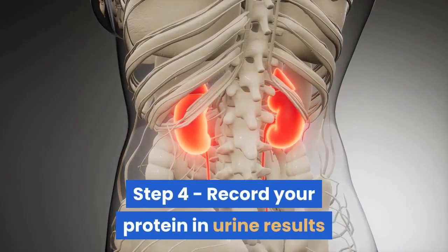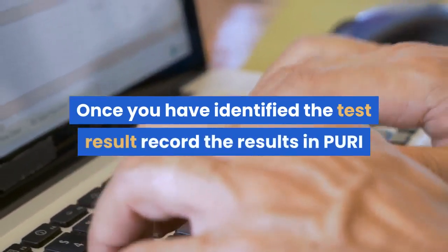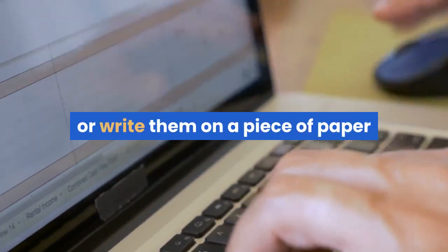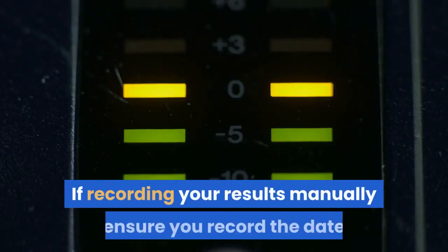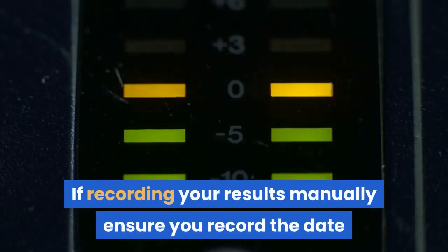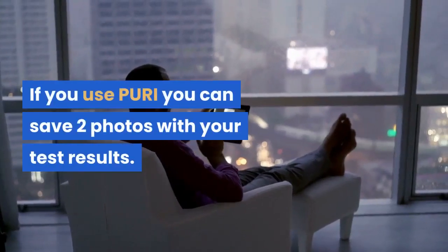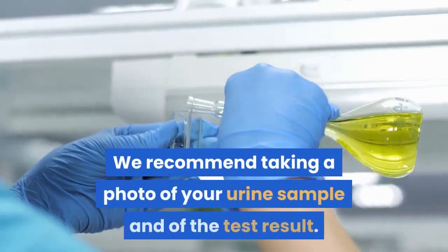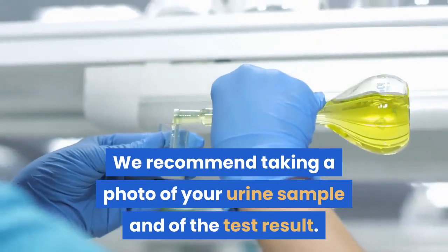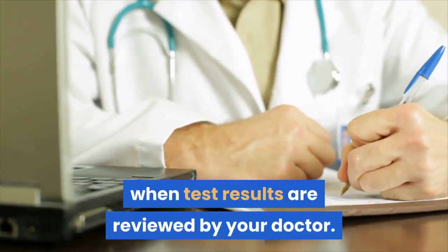Step 4: Record your protein in urine results. Once you have identified the test result, record it in Puri, or write it on a piece of paper or type it into an Excel spreadsheet. If recording manually, ensure you record the date and time as well as the result. If you use Puri, you can save two photos with your test results — we recommend taking a photo of your urine sample and of the test result. This information can be useful when results are reviewed by your doctor.